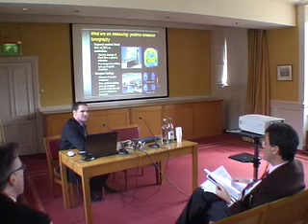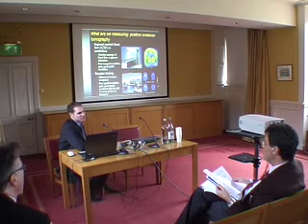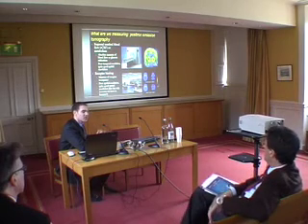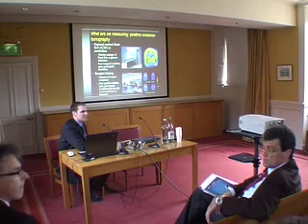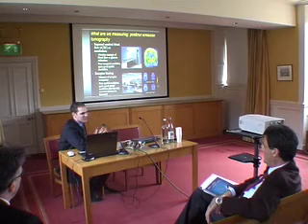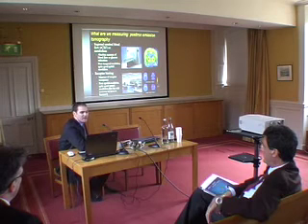However, PET studies have the relative disadvantage that they have quite poor spatial resolution, relative to fMRI. So on the order of maybe 8 to 12 millimeters in the old studies, and in the new PET scanners maybe 4 millimeters. So you can get quite good images, but not quite as good as with MRI.